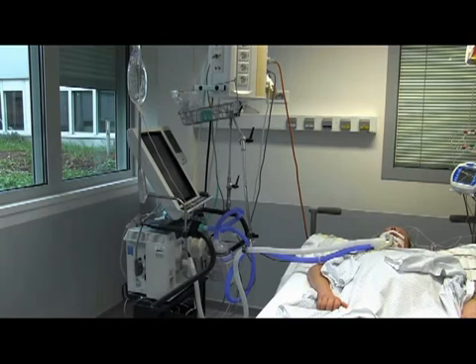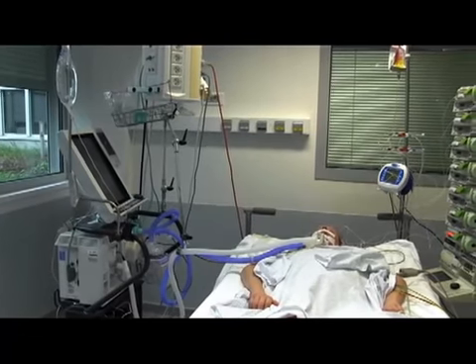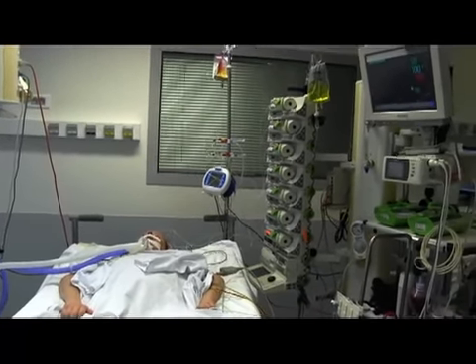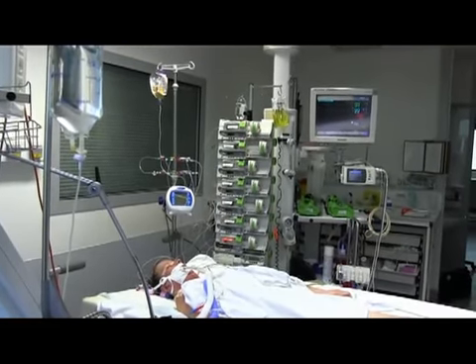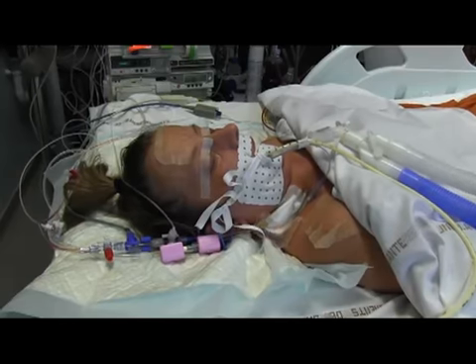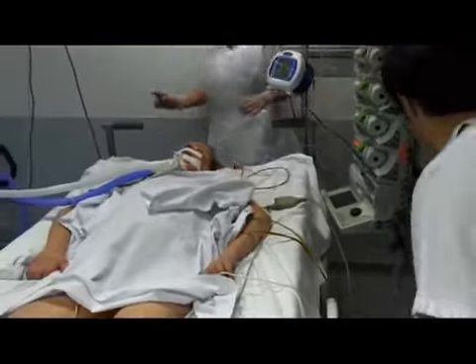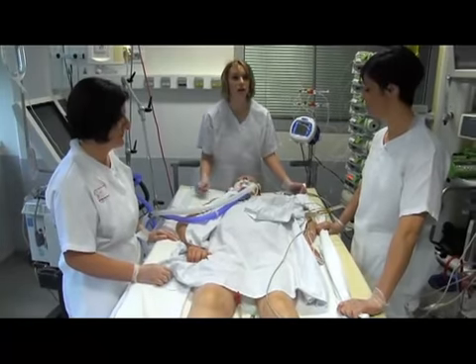Proning an RDS patient receiving invasive mechanical ventilation in the ICU must be done carefully to ensure safety during the procedure. For the procedure to be successful, it is vital to use trained and experienced staff. The procedure usually requires three to four people. One person remains at the head of the bed to secure the endotracheal tube and the ventilator lines, and coordinates the procedure. The other people position themselves on each side of the bed. The procedure is performed following five steps.